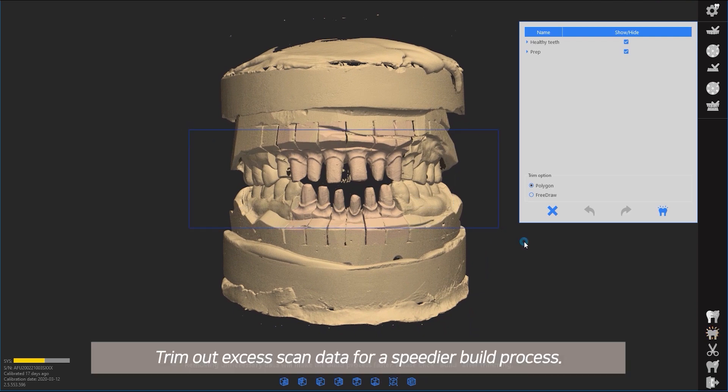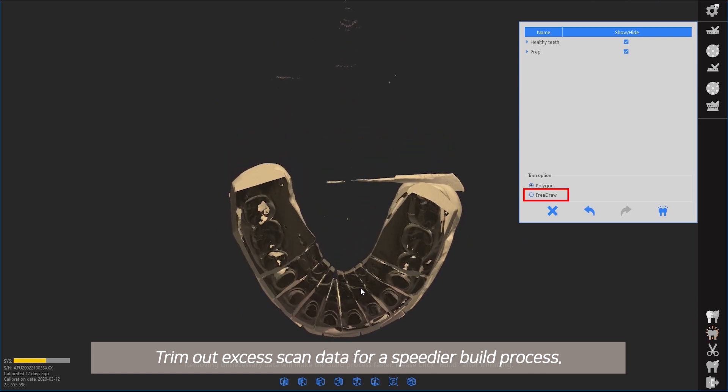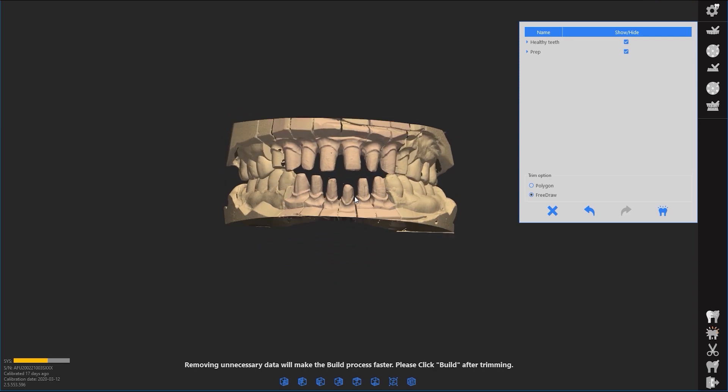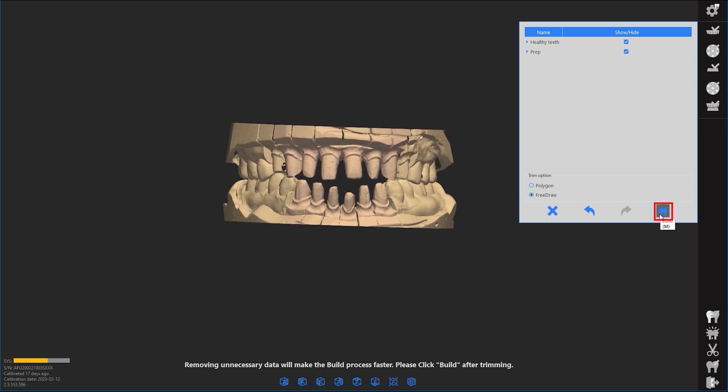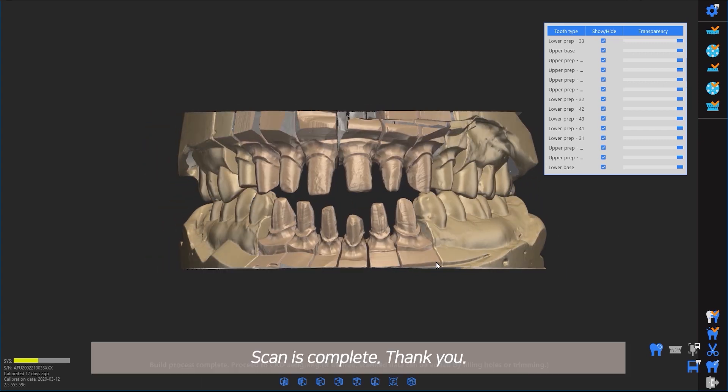Trim out excess scan data for a speedier build process. Scan is complete.